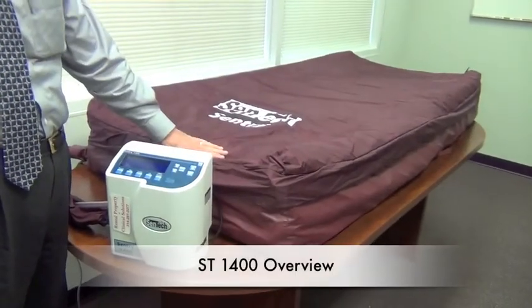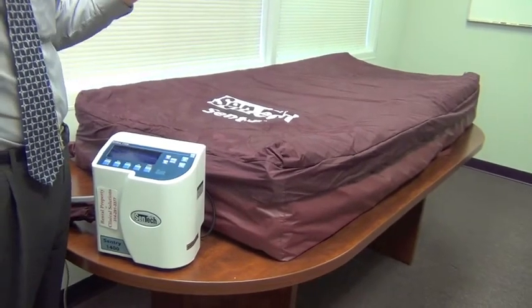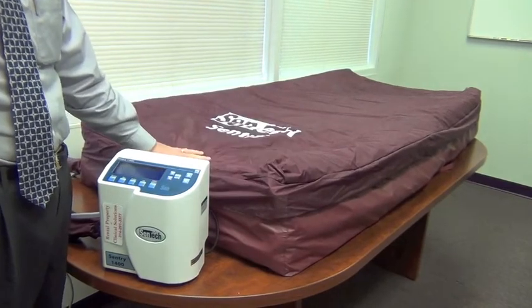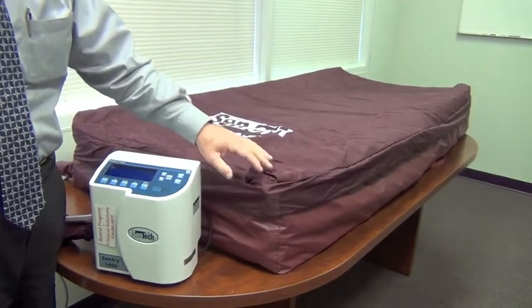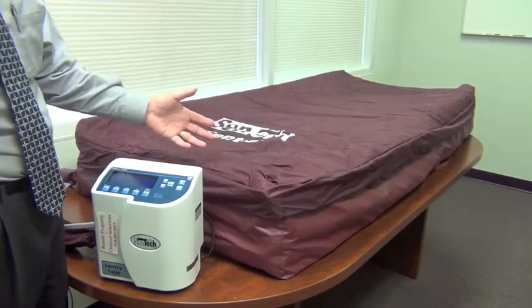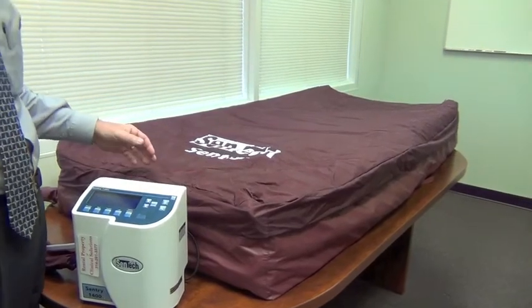This is a mattress replacement on the ST1400. It replaces the hospital mattress. So when this is put into service, the mattress on the hospital bed is removed. This is never placed on top of an existing mattress. When the mattress is removed and this is placed on the pan of the bed, it's secured to the bed frame on either side with tie downs, which are also at the head and foot of the mattress. If there's a place to secure it there, we recommend doing that as well.